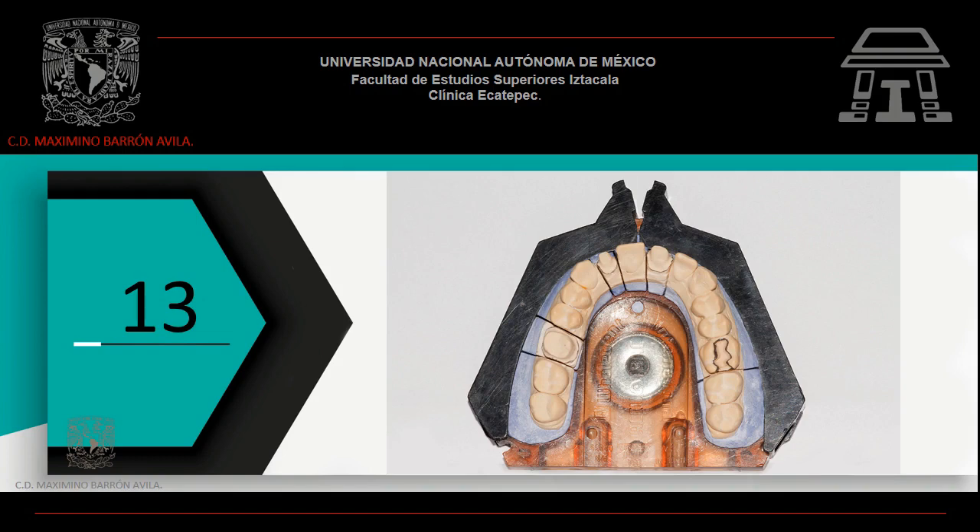Retira el sistema ACUTRAC. Abre las abrazaderas. Utiliza el reverso de la placa base blanca con relieves para la eyección del modelo de trabajo. Y hasta este momento realiza la separación con segueta de los troqueles de trabajo.